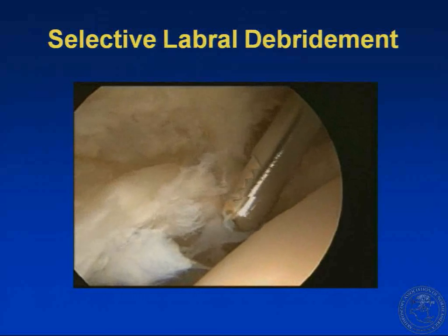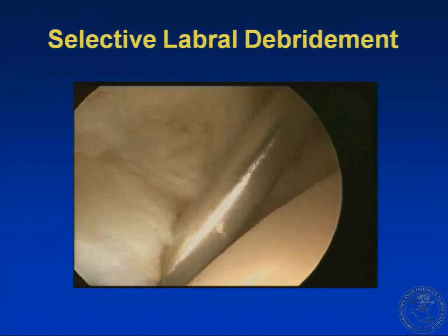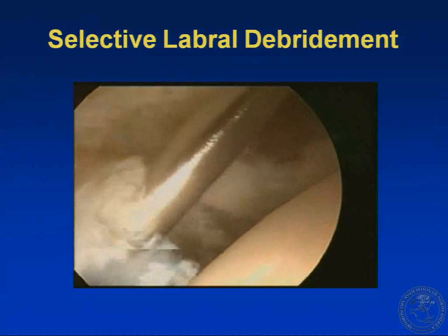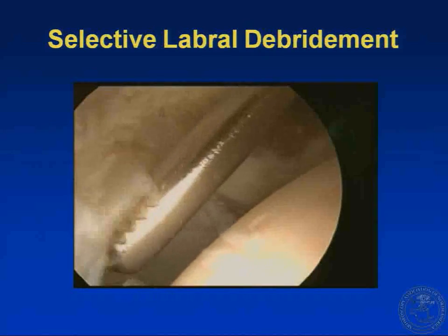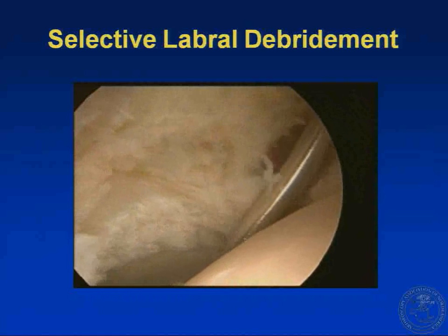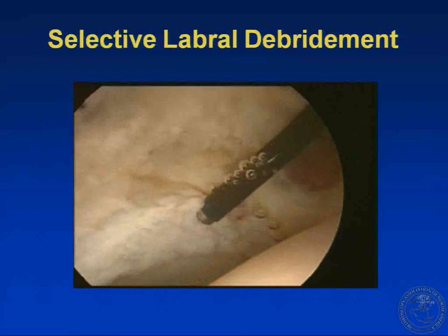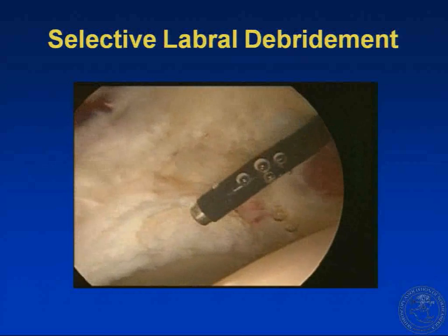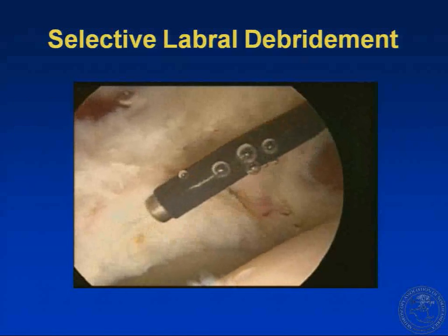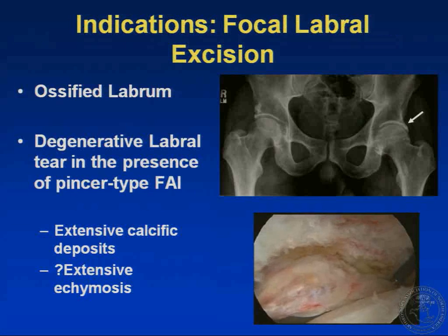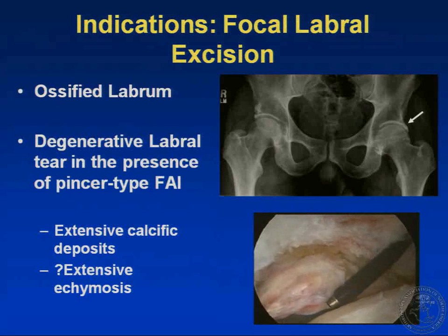This is an example of a right hip. A shaver is coming in — there's an articular-sided labral tear with no associated pincer impingement. The shaver is used to debride the labrum, and then a thermal device is used to finish the debridement, removing any unstable fragments.